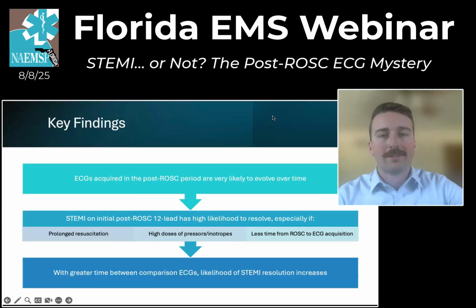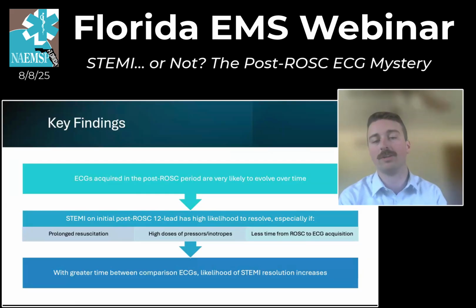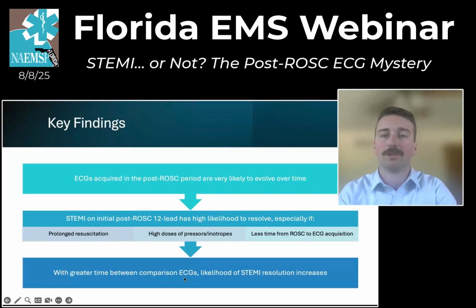So here are some key findings to summarize from what we've just gone over. EKGs acquired in the post-ROSC period are very likely to evolve over time, and a STEMI on that initial post-ROSC 12 lead has a high likelihood to resolve, especially if you have a prolonged resuscitation necessitating higher doses of pressors and inotropes, both during your resuscitation and for your post-ROSC care. And you find that with less time from ROSC to EKG acquisition, it is more likely that that initial ST elevation will probably resolve rather than persist. And with greater time between our comparison EKGs, the likelihood of STEMI resolution appears to increase.